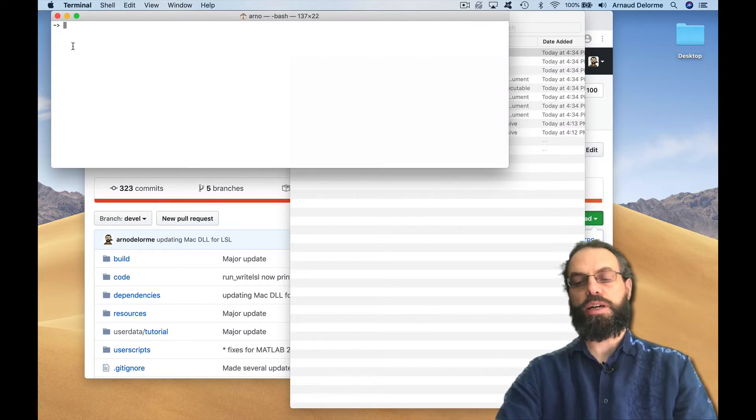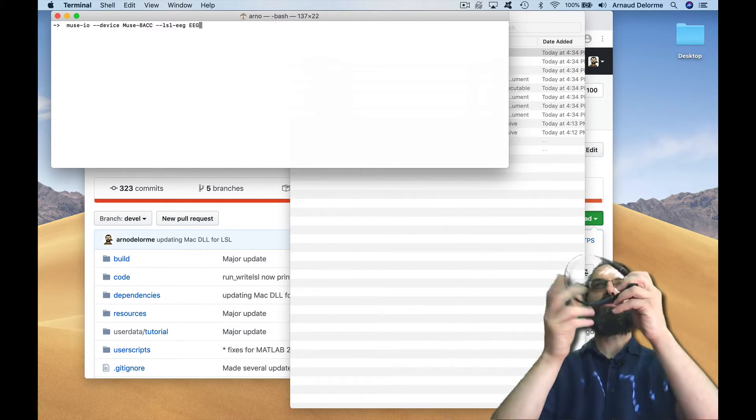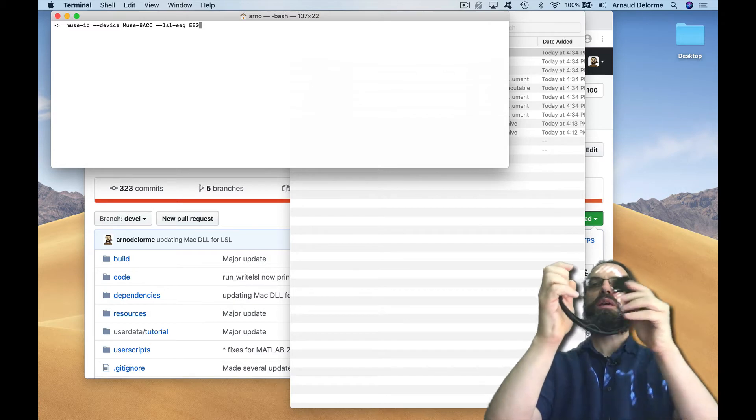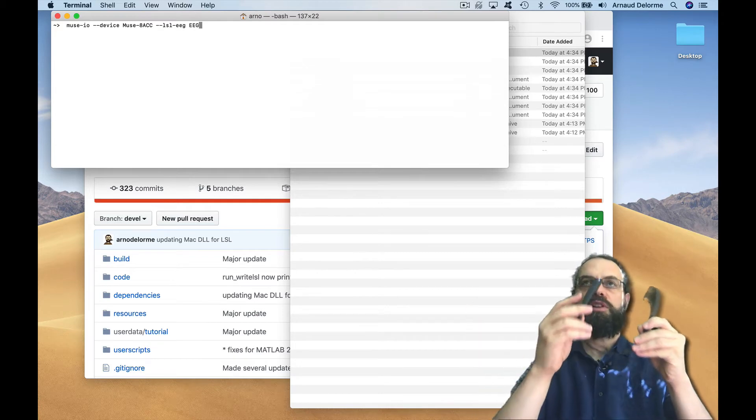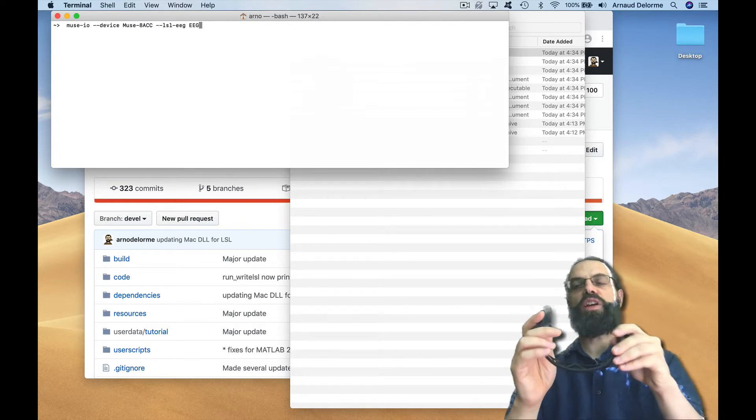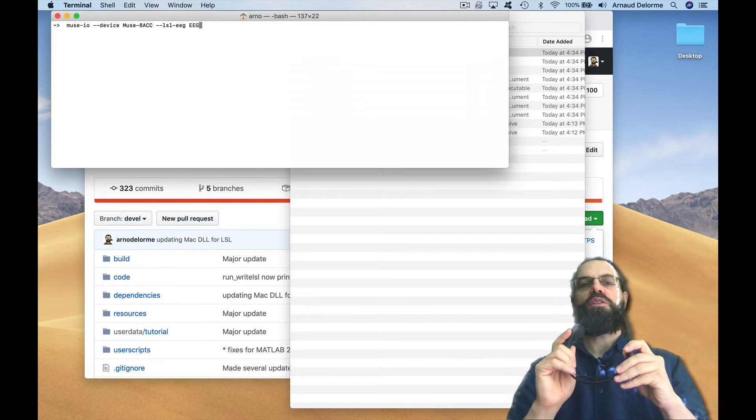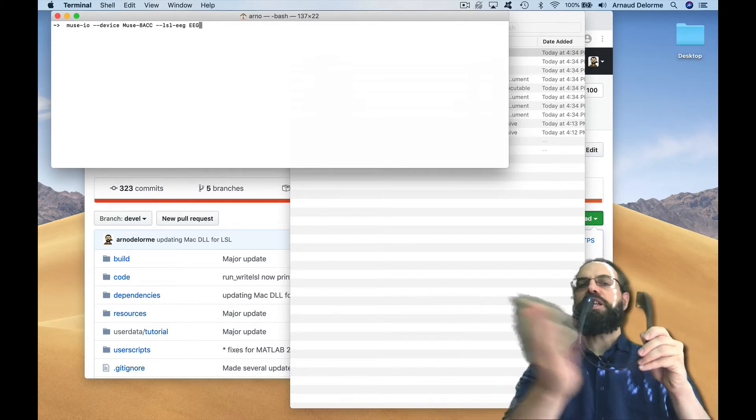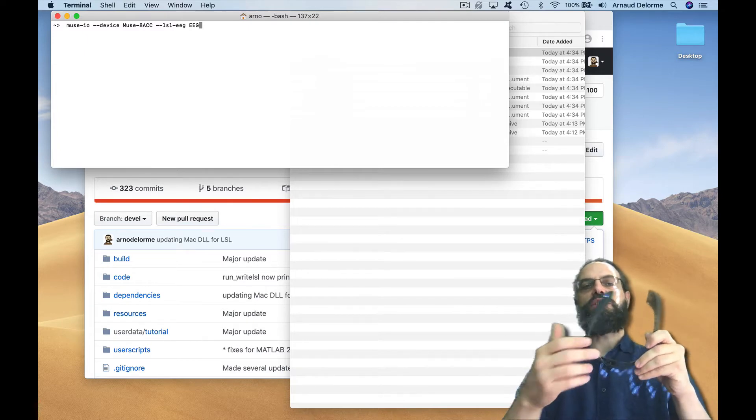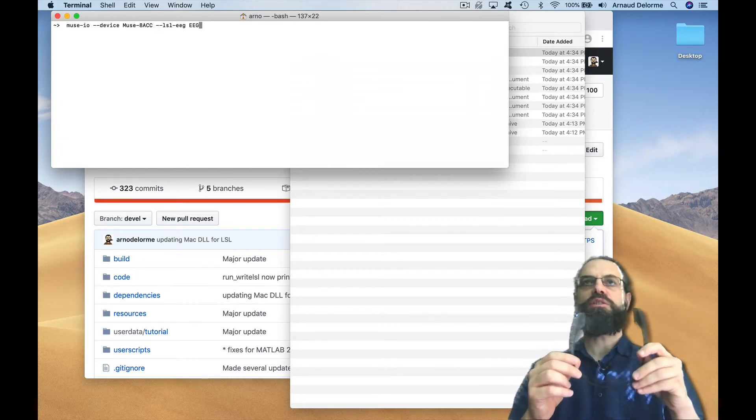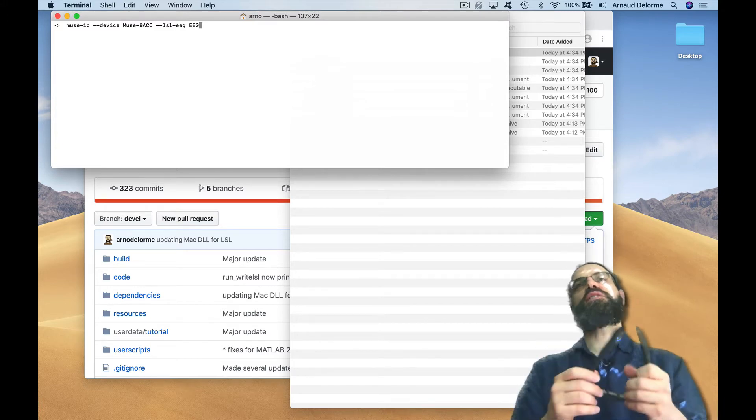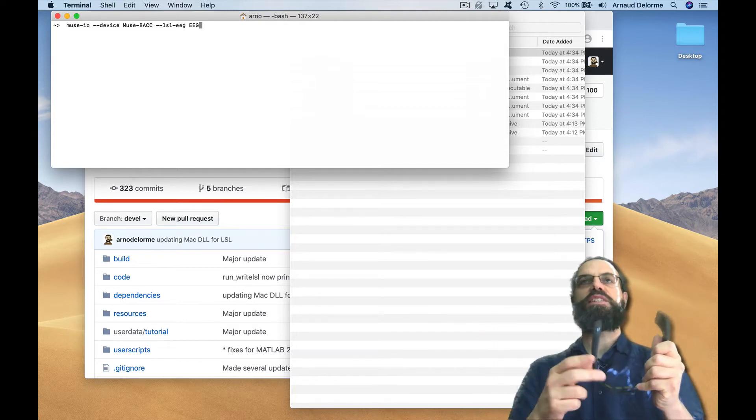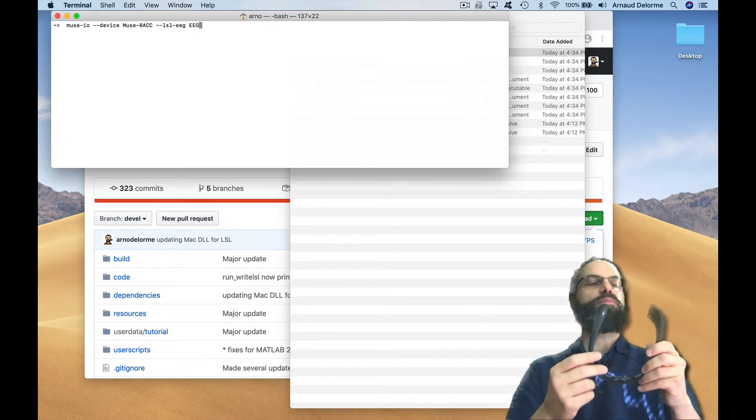The next step is to connect to the Muse headset using another program. I have a Muse headset here that I'm going to turn on. That's a Muse one. The interaction company that makes this headset had a SDK software development kit to connect to it, but they discontinued the SDK, so this only works for the older Muse. You can connect to many other headsets using LSL, Lab Streaming Layer, which is a protocol developed by our lab. You can connect to Emotive, Muse, and research-grade headsets like Neuroscan, BioSemi, ANT, Wearable Sensing, Philips Neuro, etc.